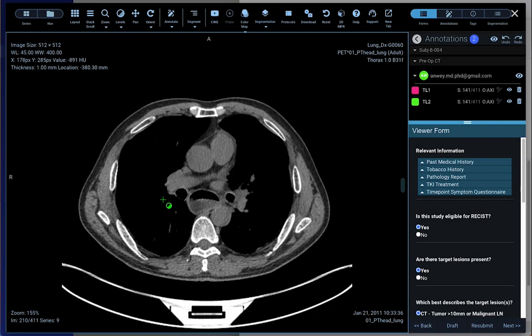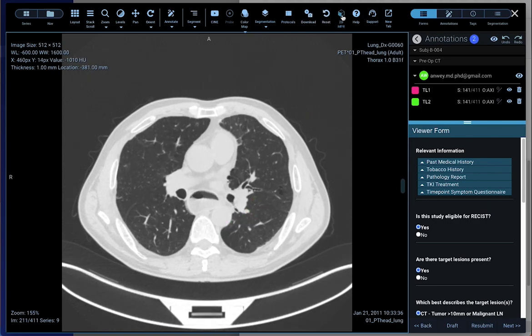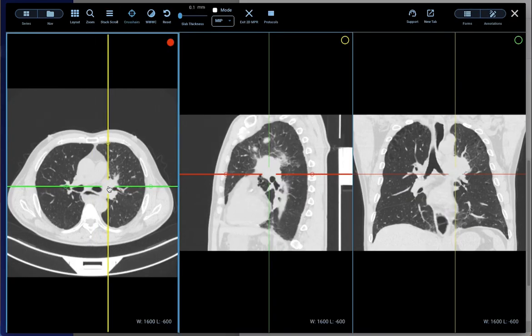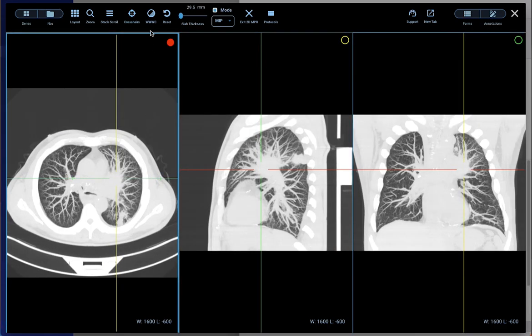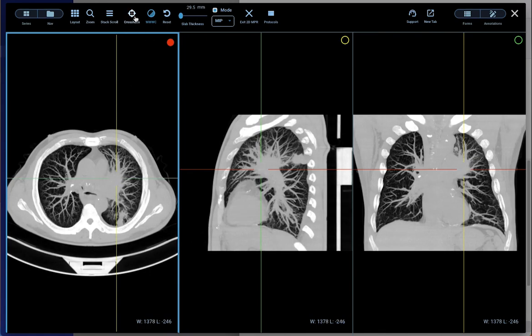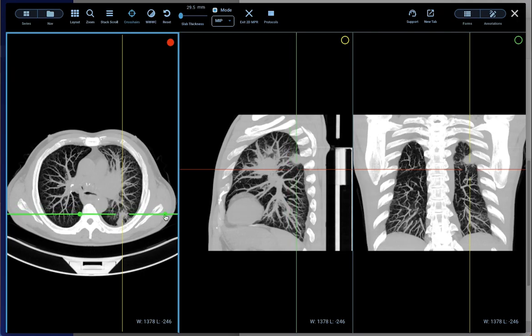Changes to the viewer configuration are also common. In this example, the testers noted the importance of having all three planes of the image visible as they evaluate the anatomic location of the tumors. As such, the protocol designer will add a custom hanging protocol definition to the configuration.